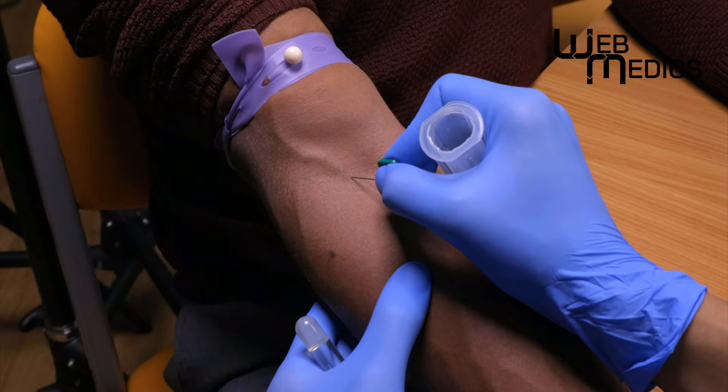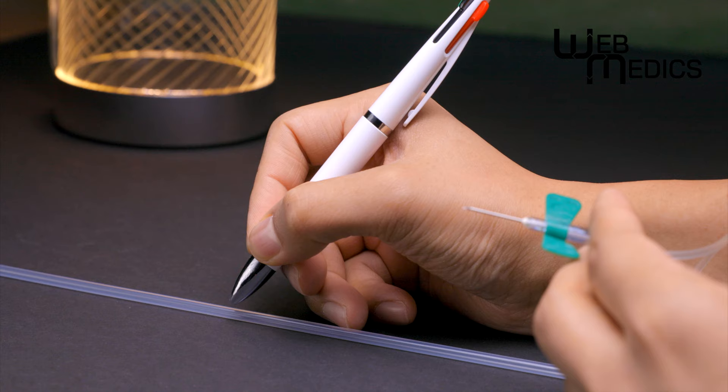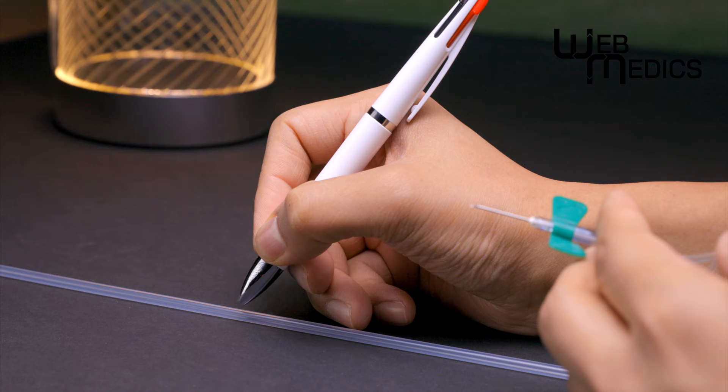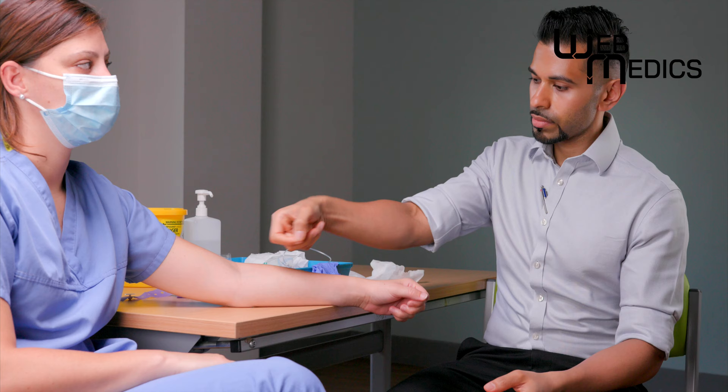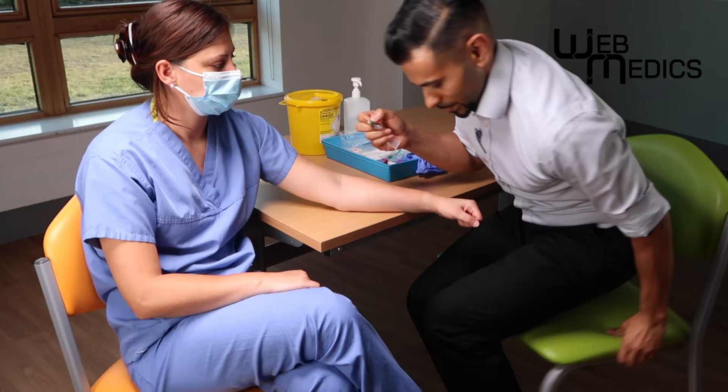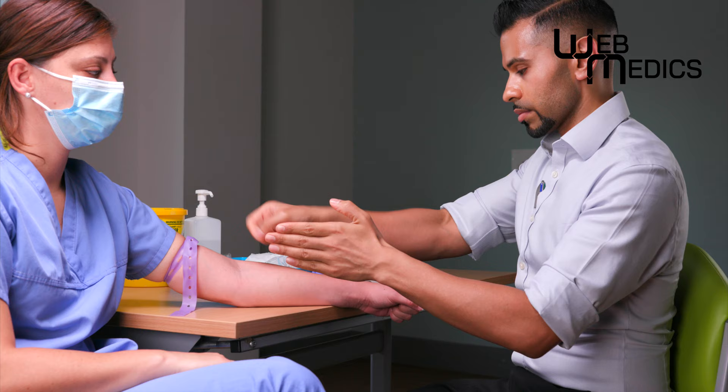So what does body position have to do with drawing blood? Well, like our writing style, we all naturally move our needles in our own line, and finding the direction of that line and matching it with the direction of the vein often means we need to re-align our body position to ensure we follow the vein with our needle line.